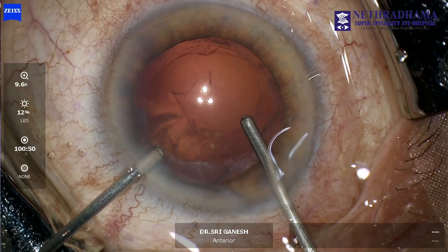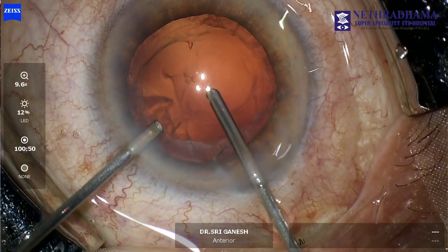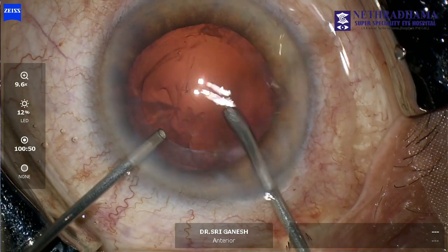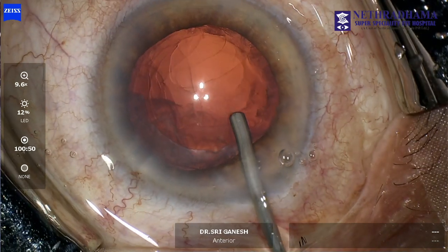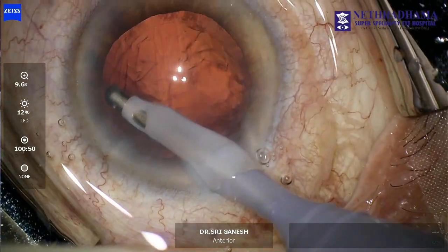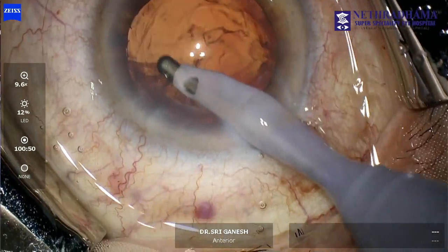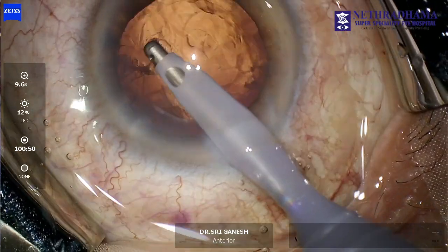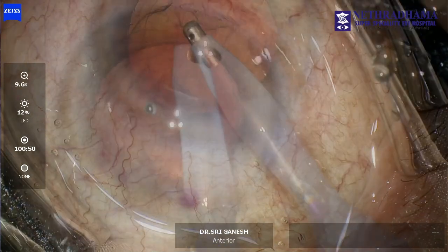The irrigation port is introduced to the side port and then vitrectomy is performed to remove any vitreous. You can be sure that you have cleared the vitreous once the margins of the PCR are not distorted and are clear. If the PCR was not punched out and was regular, I would have gone in and done a PCCC.